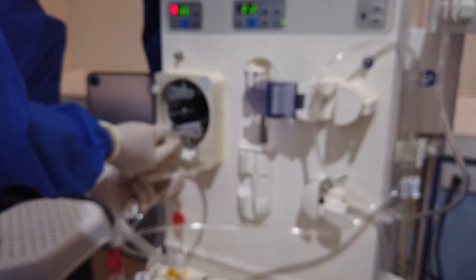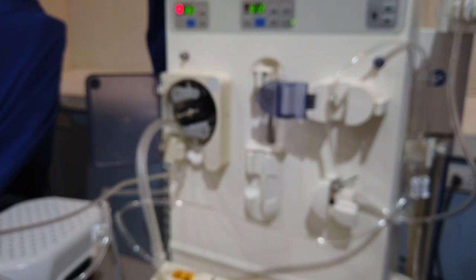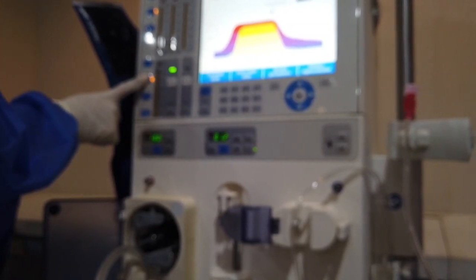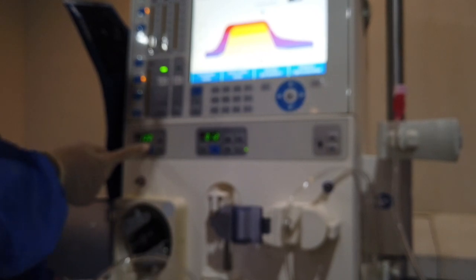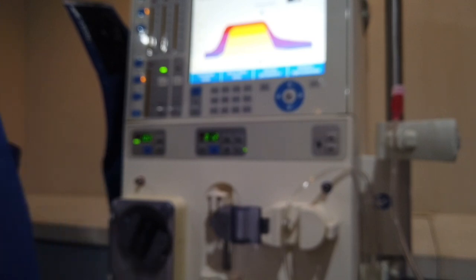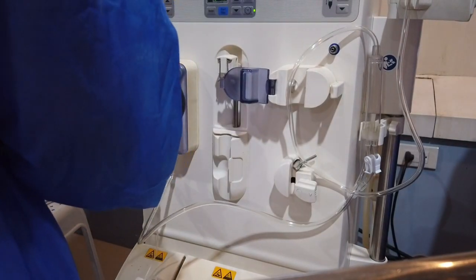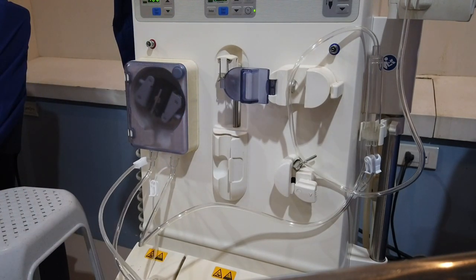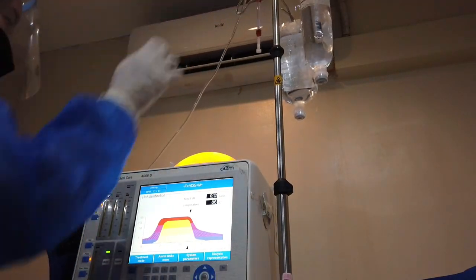Insert the blood pump segment in the blood pump housing. Turn on the blood pump for it to easily glide inside. If the blood pump button is in red light, you have to long press the prime button to activate it. Then just start the blood pump and the light turns to green. Close the transducer line clamp and as much as possible place it closest to the blood pump housing to lessen the chances of the transducer to get wet. Then hang the patient's end at the IV bag hook.